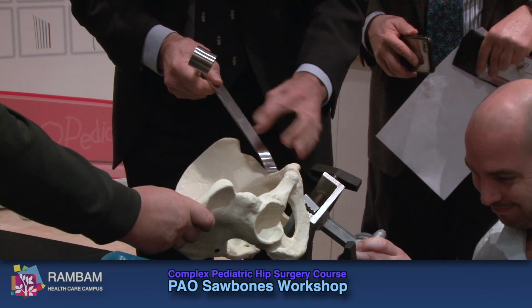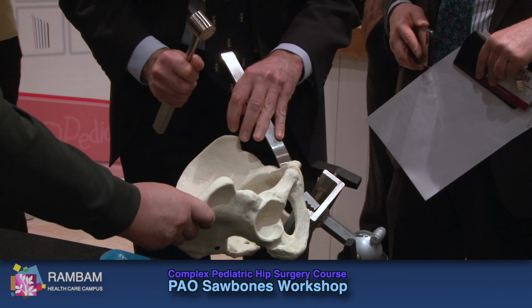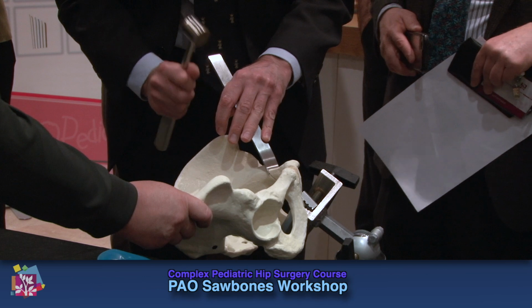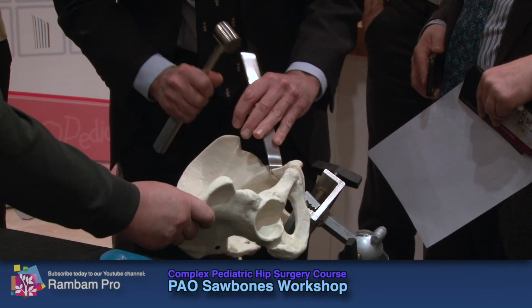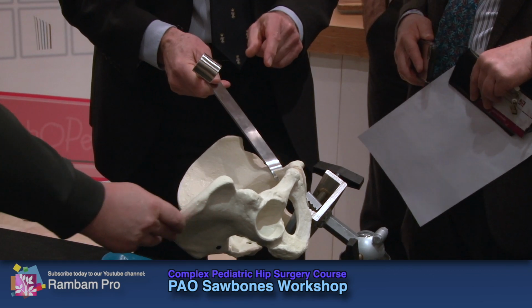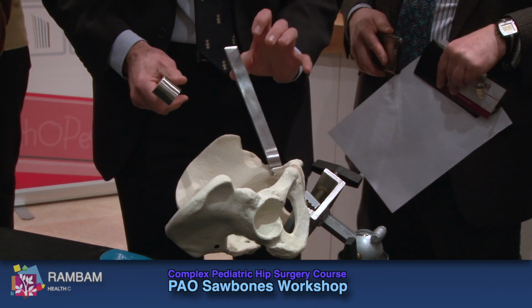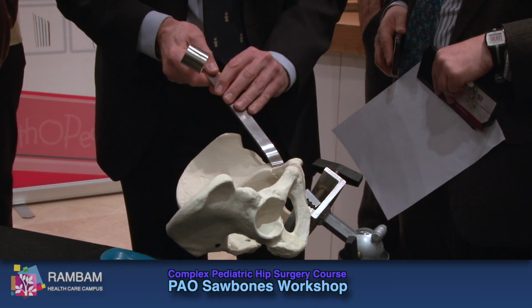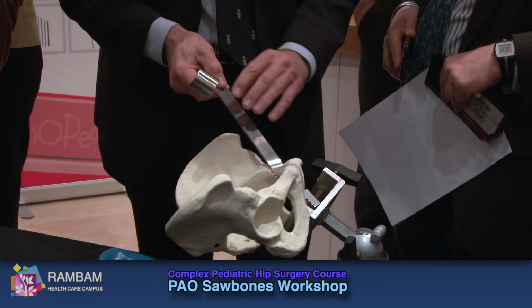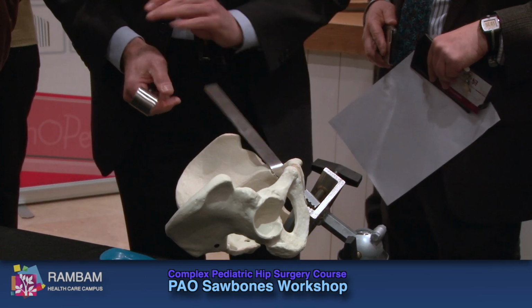Remember the nerve coming underneath here. Yeah, just that side, medial to the back. Then when in that position, take the protector and make sure that it is mobile. You can see it doing that, right? Because you want to know that at least for this cut, completely through, it's mobile, it's not going to hit there. You're not probably worrying about this cut or this cut down here. So I do that to make sure it is nicely apart.